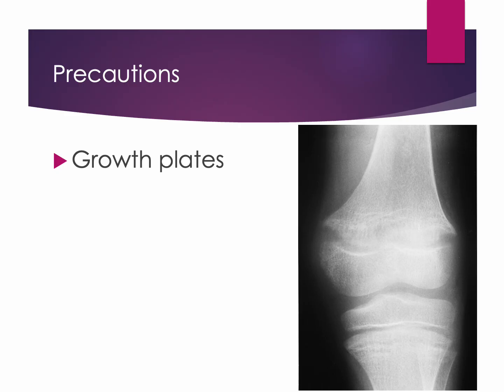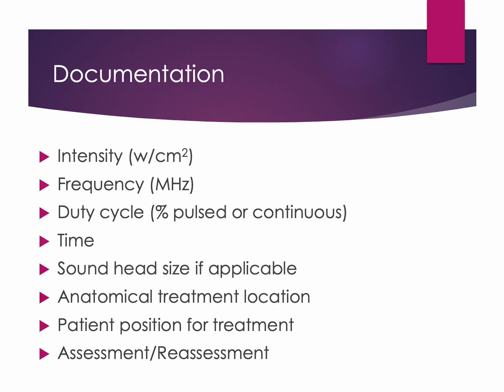In pediatric and adolescent patients, clinicians should carefully consider skeletal maturity and treatment location before applying therapeutic ultrasound near epiphyseal regions. Finally, always document your parameters clearly: intensity, frequency, duty cycle, time, treatment area, patient position, and response to treatment.